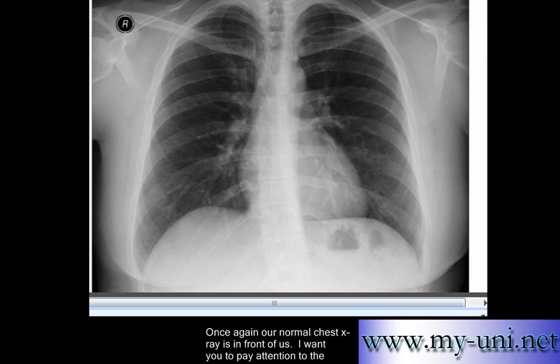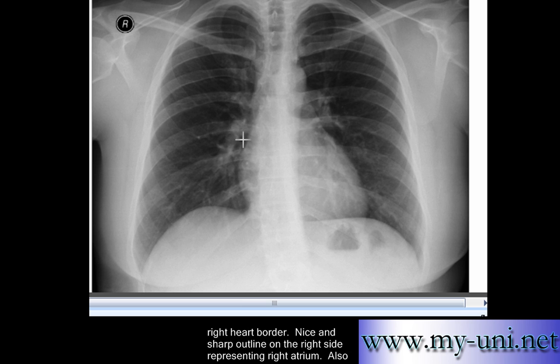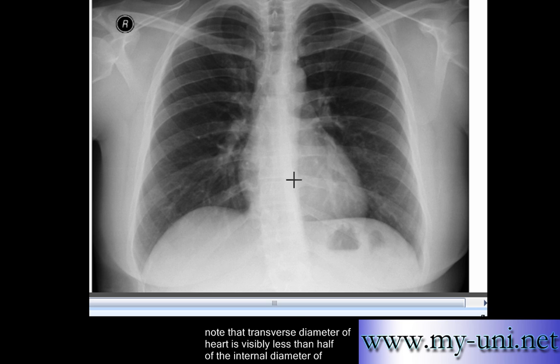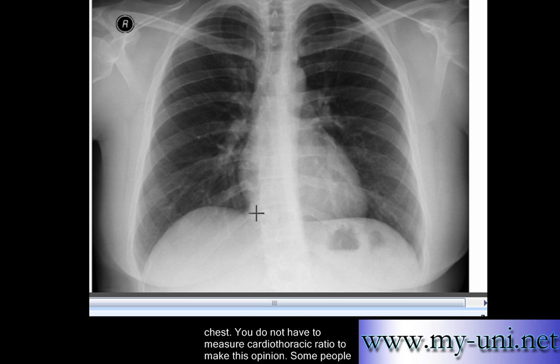Our normal chest x-ray is in front of us. Pay attention to the right heart border — a nice and sharp outline on the right side representing the right atrium. Note that the transverse diameter of the heart is less than half of the internal diameter of the chest.